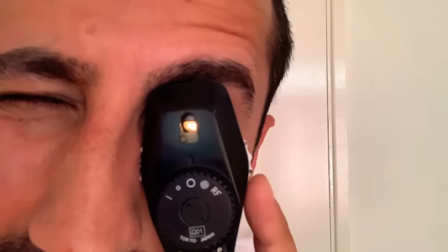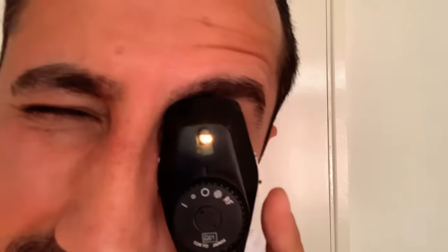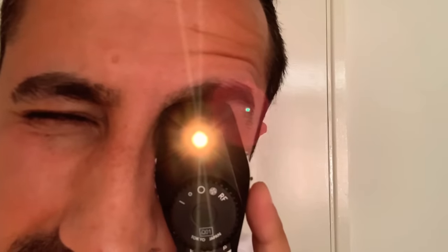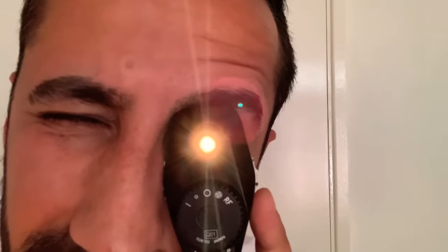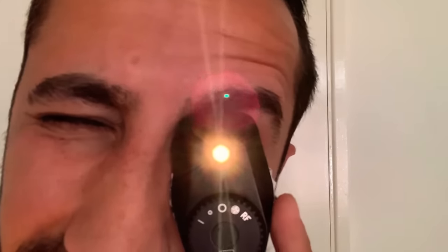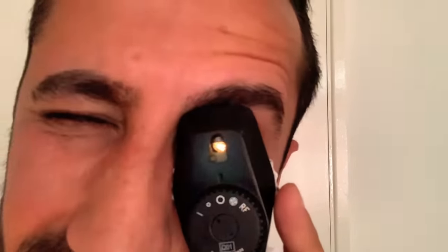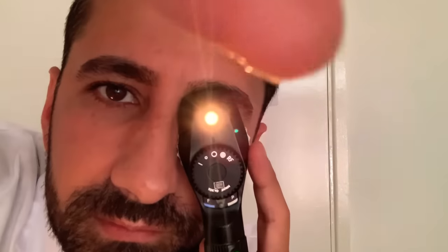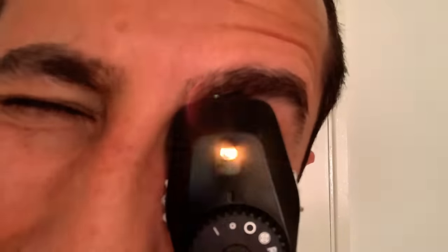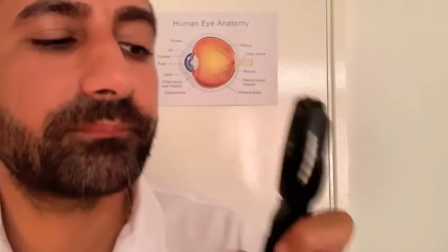Okay, optic nerve head, 0.4 cupping. Vessels, no signs of any swelling, physiologically raised now. No atrophy, no PPA. Okay, looking up, looking right and left, just down to the floor, please. Down to the floor, excellent. Into the light. The macula is fine.